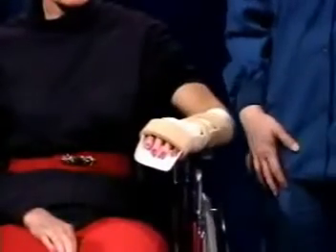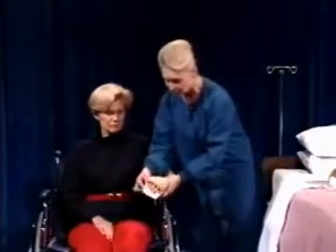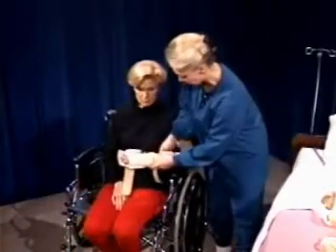A patient that's had a stroke often presents with no active movement at all of specifically their entire arm, but this is to address the areas of the wrist and fingers and to keep it in alignment. It can also be used on a patient that has tone. That means the hand is starting to get tight. It's difficult for a caregiver to passively open the hand, and this helps to create and maintain that spacing so that the fingers again will become more flexible and the patient will not develop a potential for contractures. So that's our functional hand splint. I'm going to remove the Velcro, and I used a variety of Velcro widths here to show you that you will see a variety out there. There is no precise one or two. There's many.